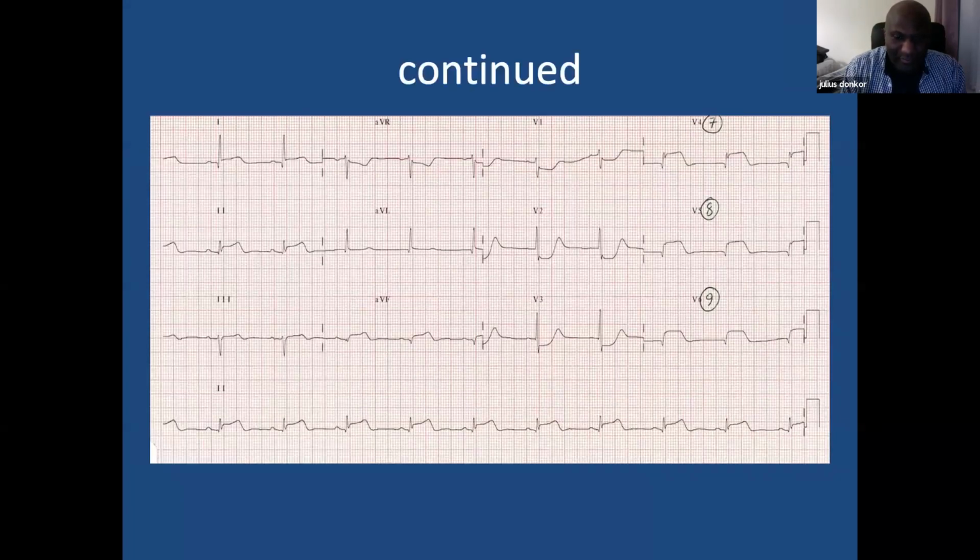Some books will say if lead 2 has a higher ST elevation. So this is the posterior ECG recording I was speaking about. I actually forgot I had it already. You remove your V4 to V6, and then that becomes V7, V8, V9, and you can clearly see your ST elevation there if you're doing a posterior recording.